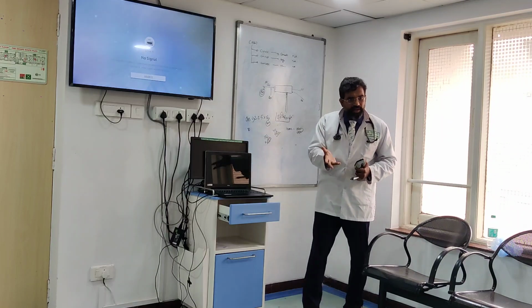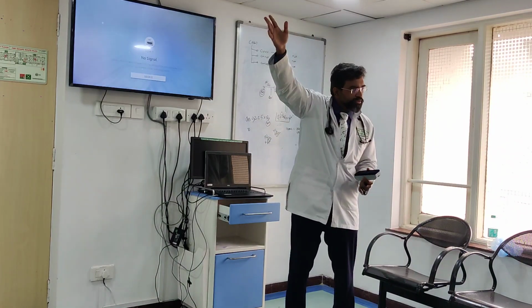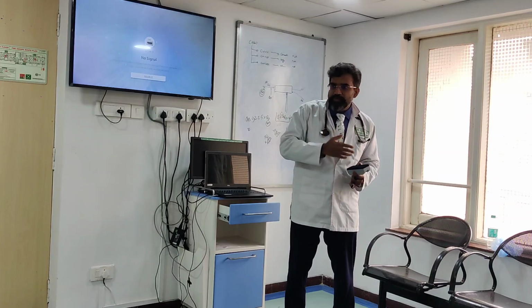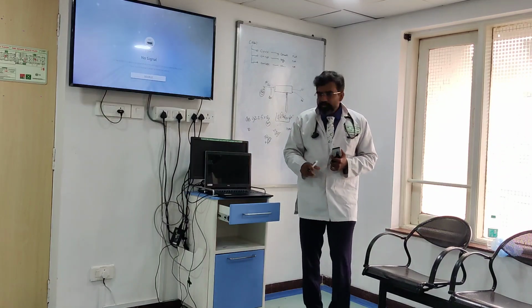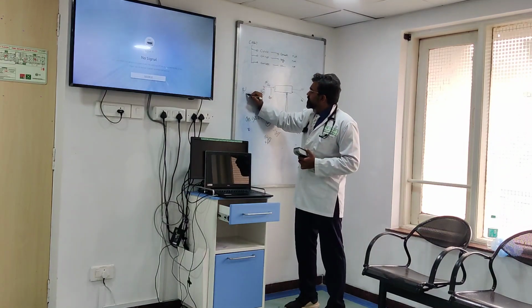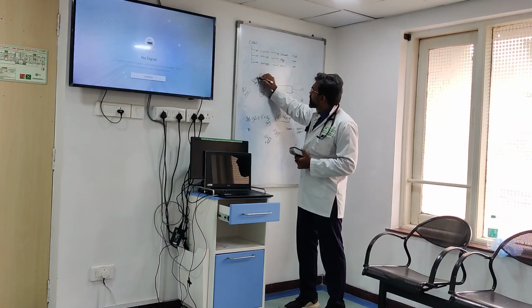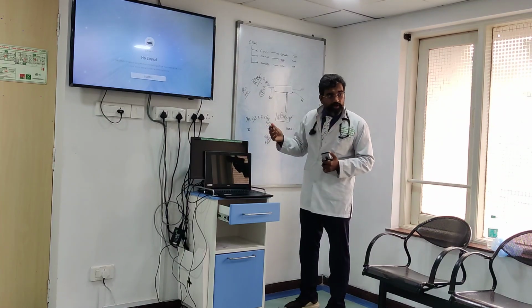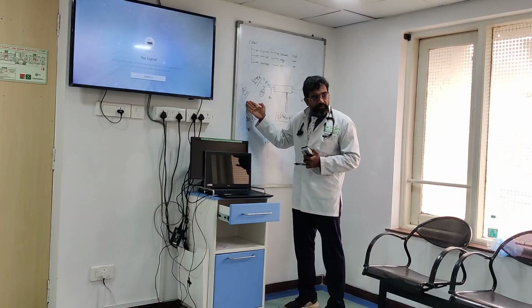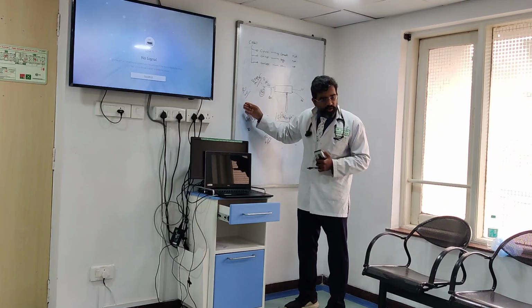So when you're starting also, you must start like that. When you're starting your dialysis machine, you don't start at 50 and 1000. If you start at 50 and 1000, what is going to happen? The chances of filter clotting is high, no? 50 into 60 is 3,000, and say you take 1600 over here, into 2.5 it will be 4,000. So it will be 4,000 and this will be barely 3,000. So 3,000 versus 4,000. Will the filter clot? Yes, it will.